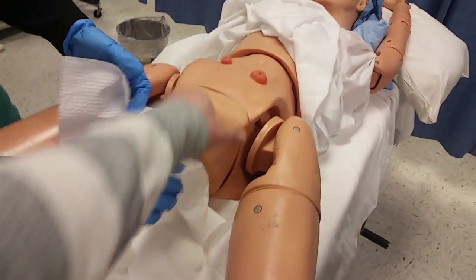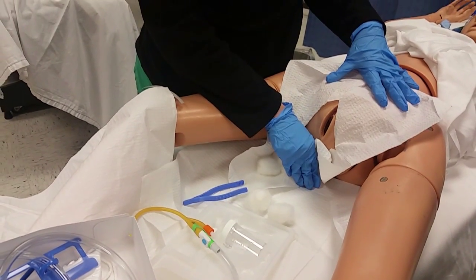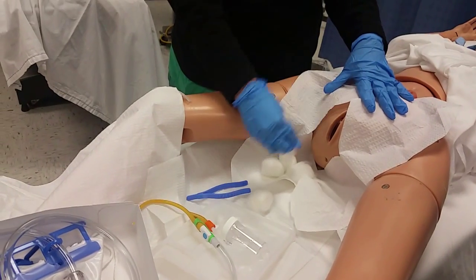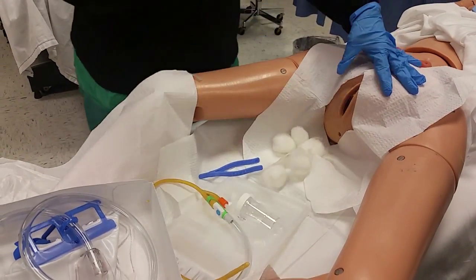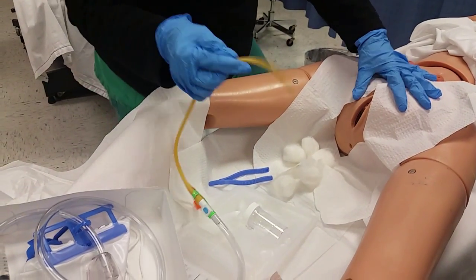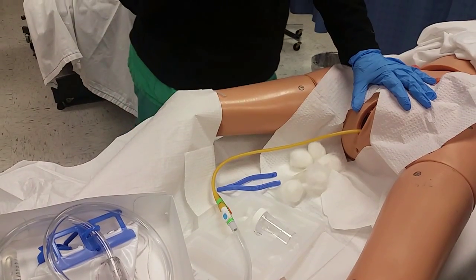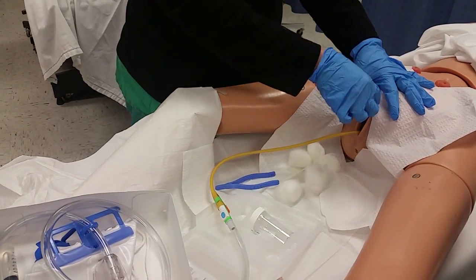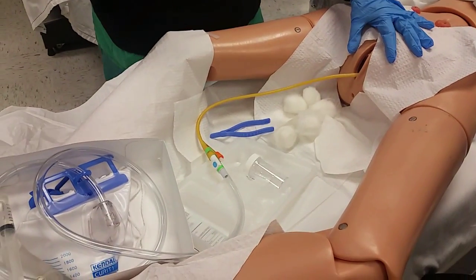So you rip the top of this little drape right there, take this part of the drape and wipe the betadine off, because there's a lot of betadine and you want to make sure you're covering that surface — if you see skin that's not betadine, you're not doing it properly. When you start wiping, they'll say it winks — where you should insert the catheter. If you were doing this on a female and went into the vagina instead of the urethra, you would leave that catheter there and have somebody get you another one. You leave it there as a landmark — you don't blow it up.